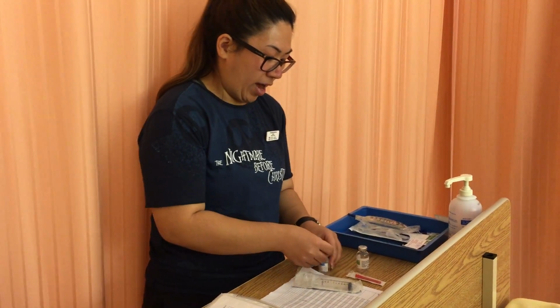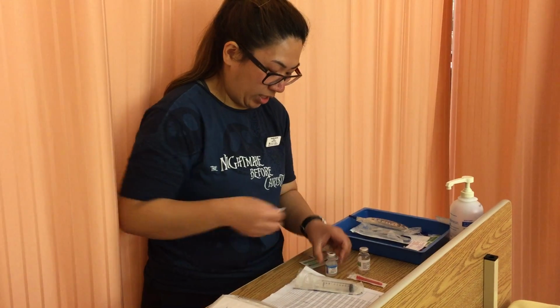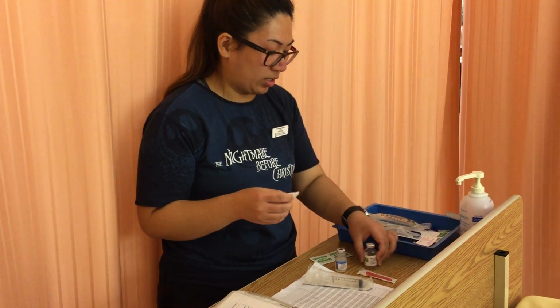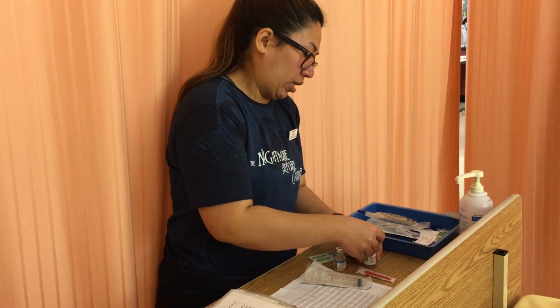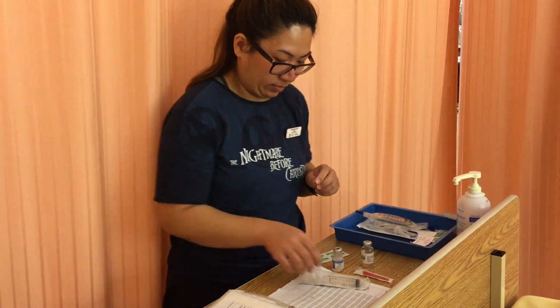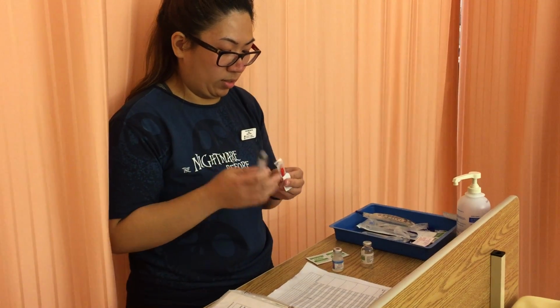I would clean my vial of sterile water for about 30 seconds and leave it to dry for about 15. Same as my cefoxitin vial, clean for about 30 seconds with alcohol swab and let it dry for about 15. Now we're gonna use our syringe and blunt needle.